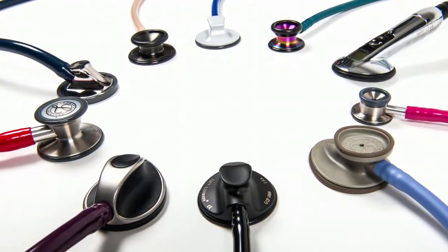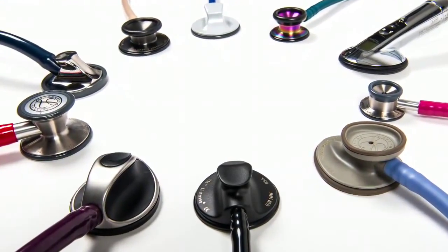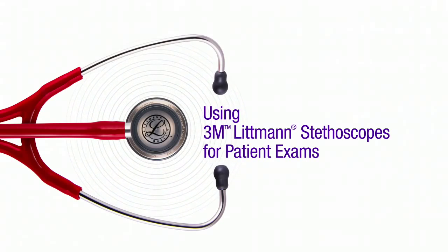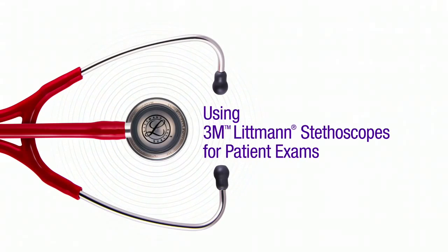3M Littmann stethoscopes are designed for all types of body sounds, patient conditions, and physical environments. In this video, we'll review auscultation best practices for performing a patient examination.